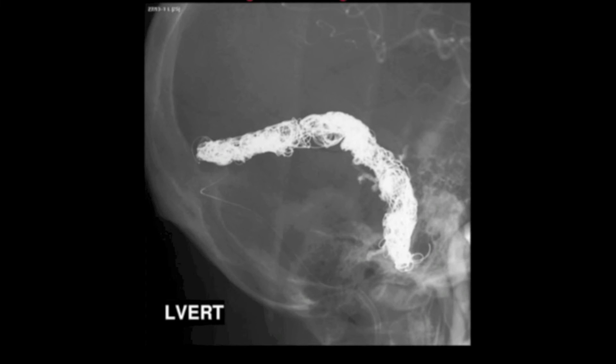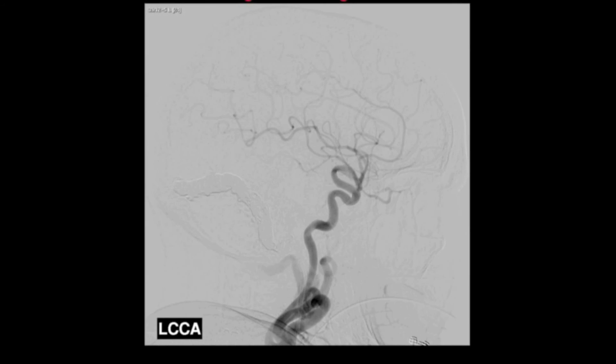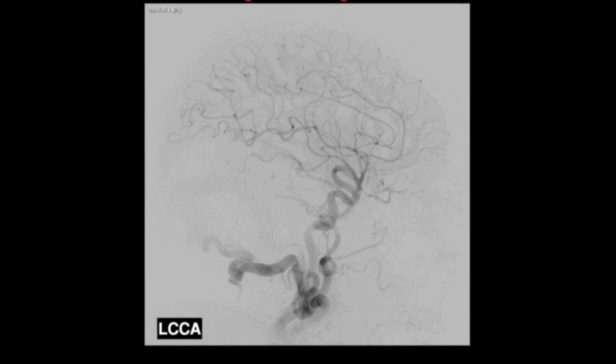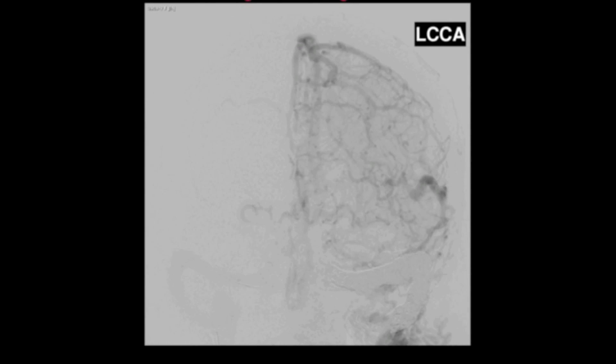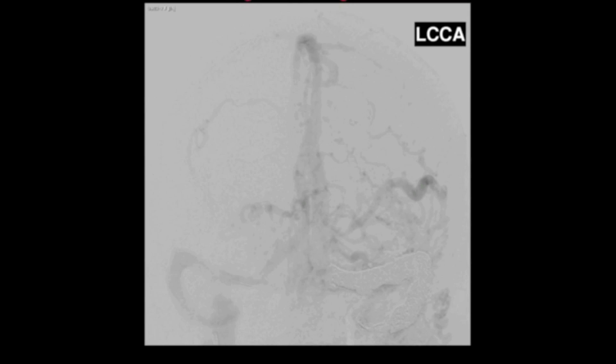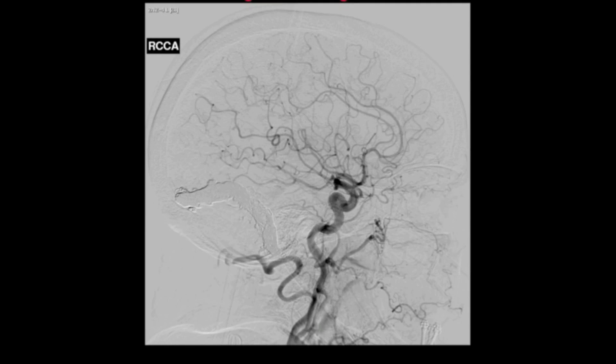Onyx embolization through the second microcatheter progressively occludes all fistula connections. Immediate post-procedural angiography demonstrates complete obliteration of the fistula and normal cortical venous drainage has been restored. The Towne's projection demonstrates how coil and Onyx embolization of the fistula up to the level of the torcula has completely obliterated the fistula's connections while preserving normal venous drainage. Note that abnormal feeders from the right internal and external carotid artery are also eliminated after embolization.